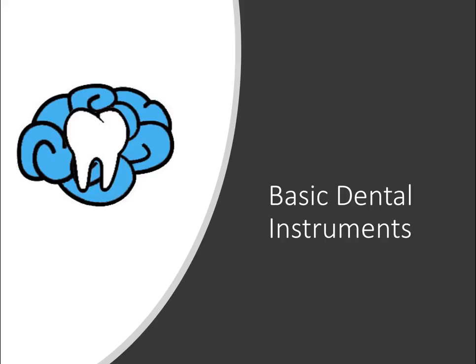Whether you're joining the dental workforce, maybe you're interested in pursuing dentistry as a possible career, or maybe you're a patient and just want to learn more about the field. Well, this video is designed to give you a basic understanding of different dental instruments and what they are used for. So sit back and relax as we dive into the world of dentistry.